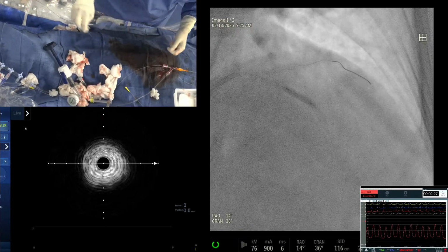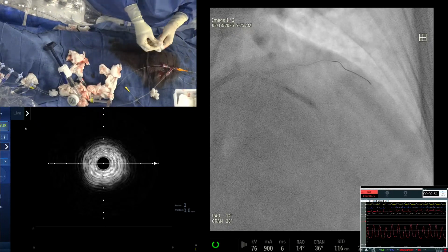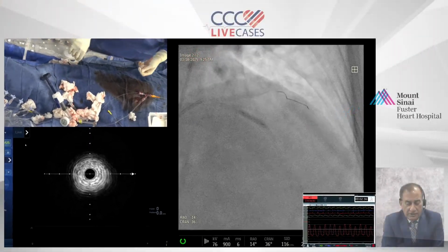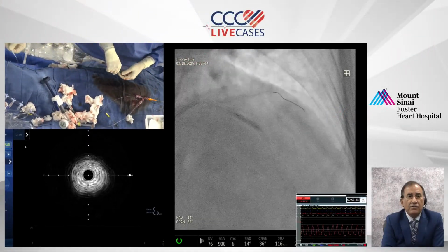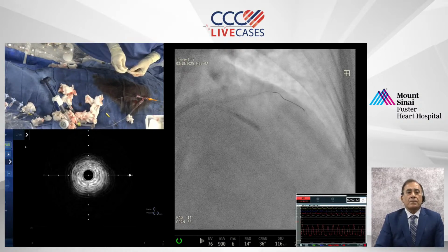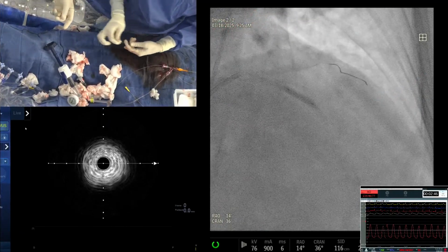No? Why? What is happening? There's a problem with this third wire. Anu, a question for you: could you change the recrossing of the strut? They have done it a few times. We did it 2 times. That's what I asked earlier. That's the first thing you do, change the strut. But even that was not easy.